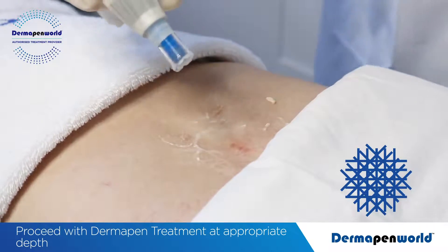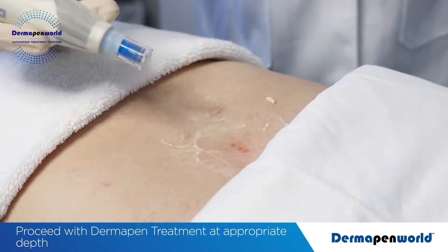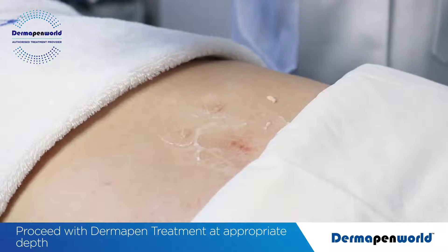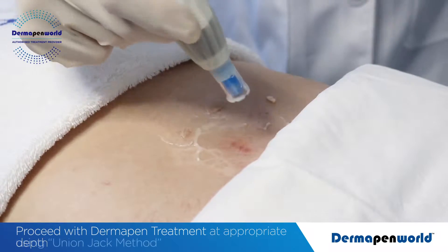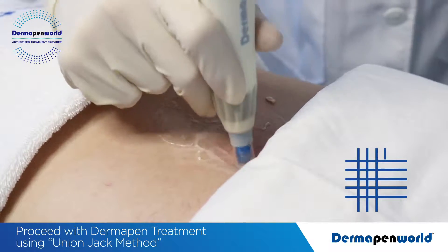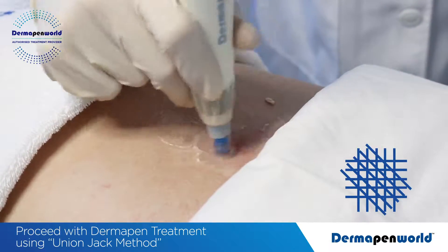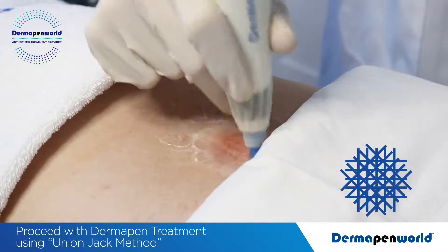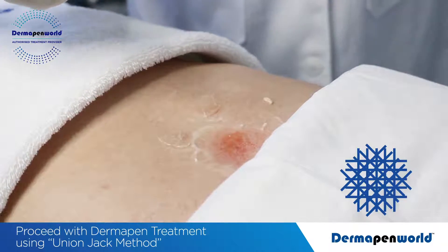Check the area to determine the visual endpoint. We see that no pinpoint blood has come out, so simply increase the Dermapen up to 2mm for this patient's instance. Again, pass over using a combination of vertical technique, horizontal, diagonal 1 and diagonal 2.